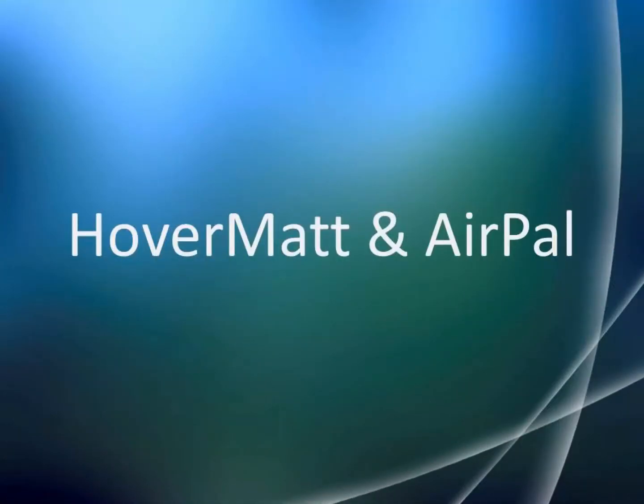The Hovermatt and AirPal are patient transfer devices with mattresses that float on a cushion of air for safe and easy patient transfer. We have mattresses and air supply devices from both companies, and their parts are interchangeable. The mattress is radiolucent and artifact-free, so safe for all radiographic procedures. This device is used for patients in red and some patients in the yellow category.